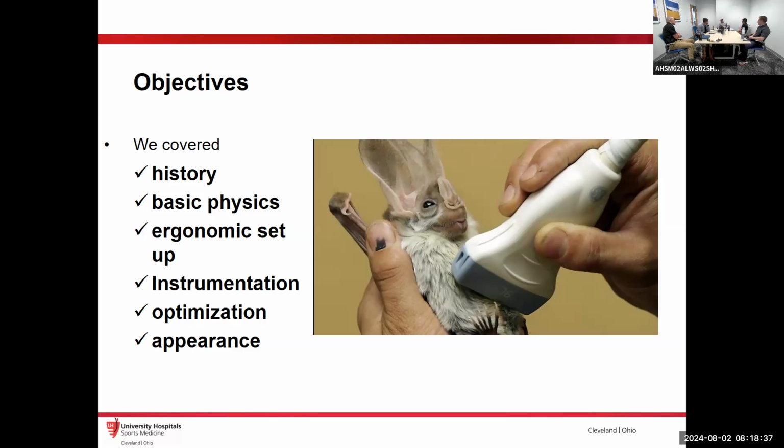The Samsungs have it. I don't think any of the Sonosites do. I know none of the GEs do. And it's one of those things where, can you manage with the linear? Sure, you can. Is it worth $7,000? That's the one thing that we need to go over. Is it worth $7,000 to you to switch and get a hockey stick? Unless you're doing a ton of median nerves and small joints, probably not. You can manage with it.